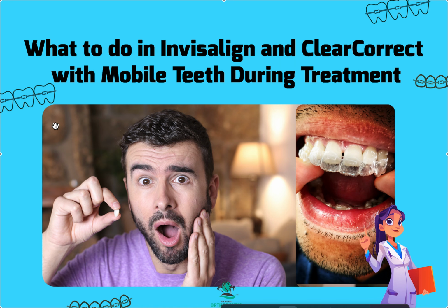Now, here's the caveat. What if they round tripped? If they round tripped, it's not going to say that it moved buccal, because it actually ended up at the same location eventually. But they moved it forward in order to make space so you could do the IPR to move it back. That's called round tripping. And if you don't understand what round tripping is, you need to watch my other videos on round tripping.